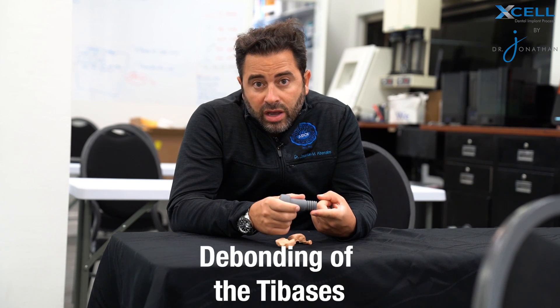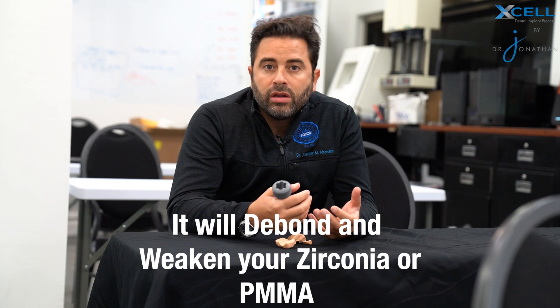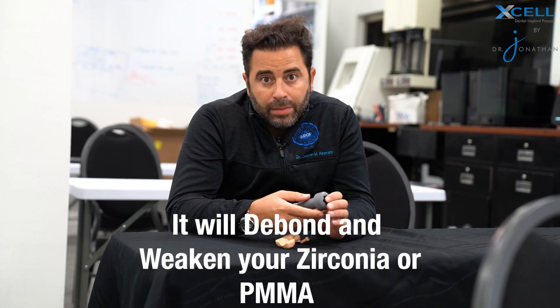The Powerball screw really came from myself, for my own patients, to be able to fix a lot of the issues that we had. The number one issue was either debonding of the tie bases or fracture of the zirconia. When you go ahead and put a tie base in, not only is it going to debond, but it will weaken your zirconia or your PMMA prosthesis.